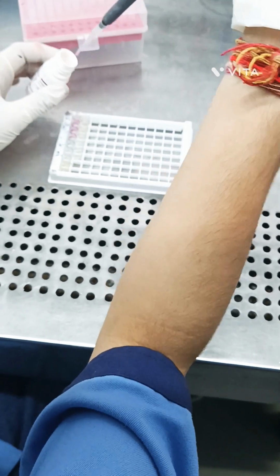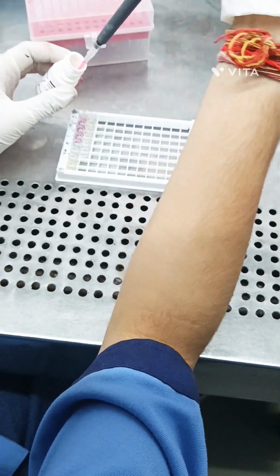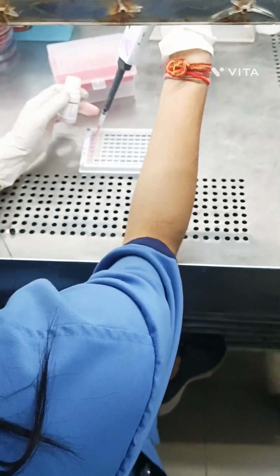Safely cover the plate and incubate. Add directly in the sample or standard dilution.